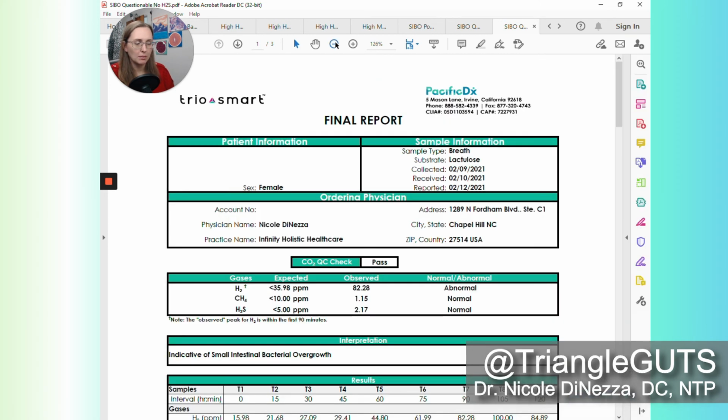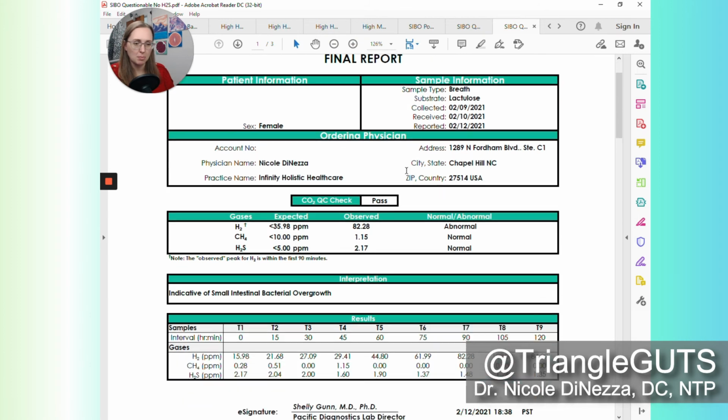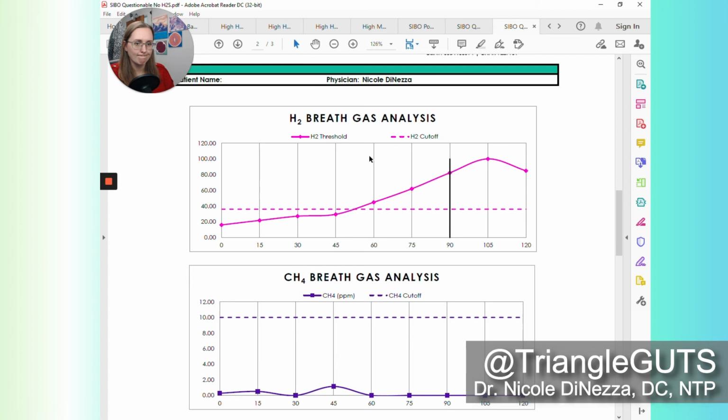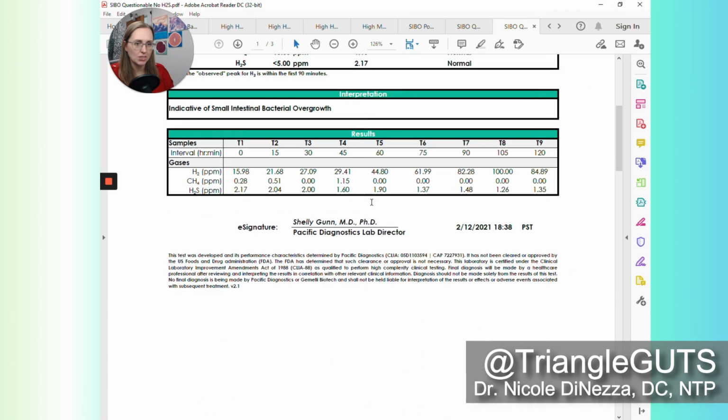All right, another one. Okay, this is a lactulose test. So again, we have to keep in mind that speeds up transit time. It looks like there are no invalid samples, and it looks like, oh my, this person must have quite the case of hydrogen. Let's find out more. This is a tricky one. All right, let's look at the 60-minute mark. Let's look at the difference between 0 and 60 minutes and see if that crosses the 20 parts per million mark. Let's take a look-see.